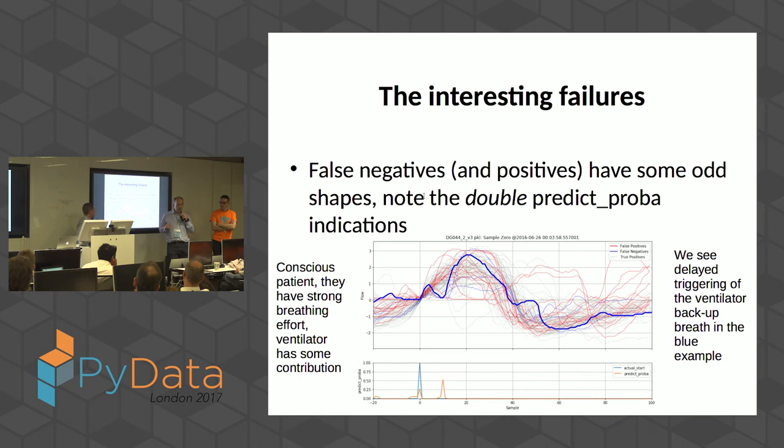But I have to look at more than what we looked at here, because this one is based on the flow. When I'm looking at it, I'm also looking at the pressure. So I'm looking at the pressure and the flow at the same time, and clinicians can reason when the breath starts by looking at the flow and the pressure at the same time point on a particular curve. That's the answer. Do you use both signals in the learning, or are you just working from the flow?